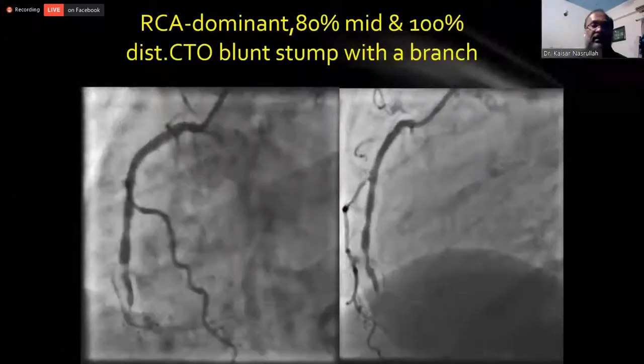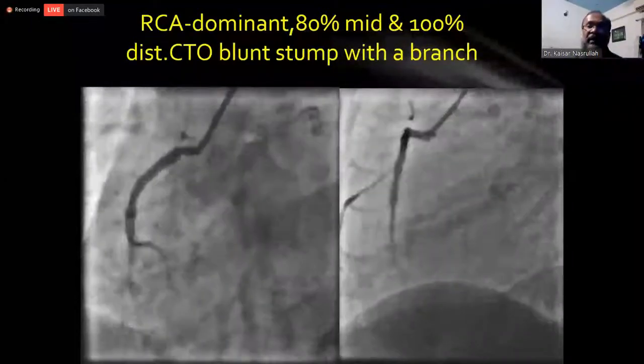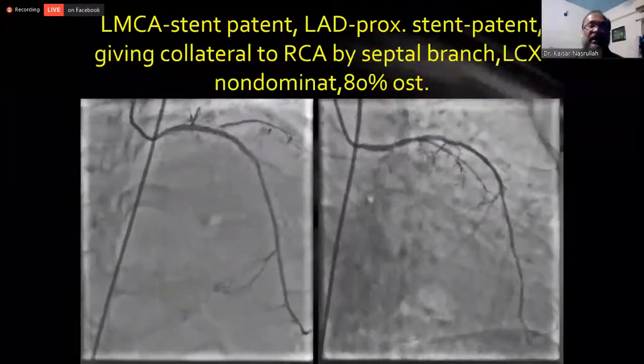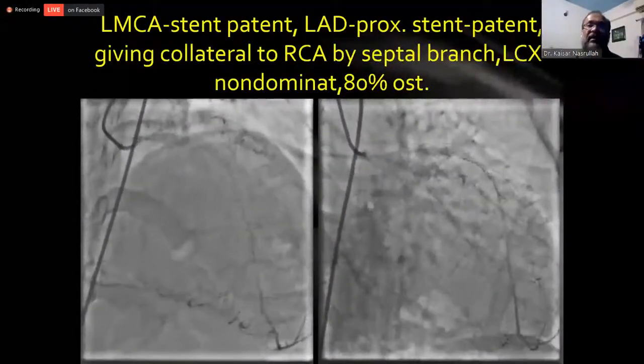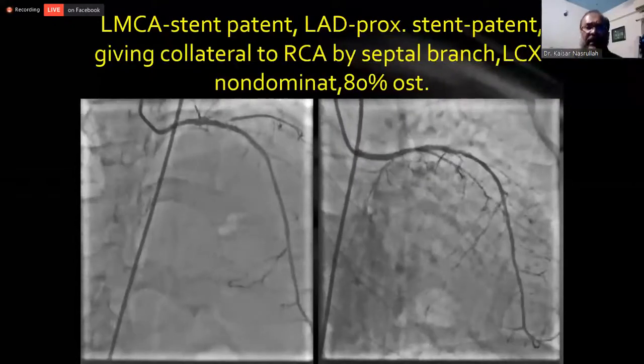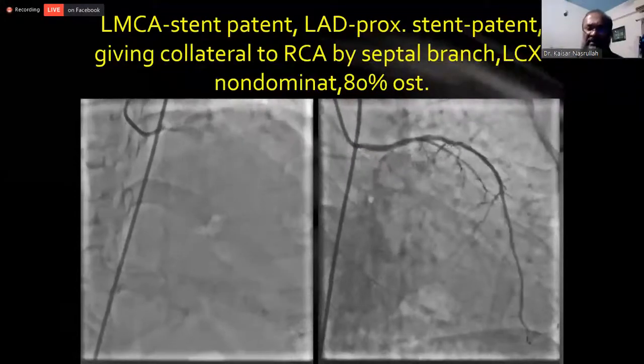So this is an example: RCA dominant, a CTO with a blunt stump with a branch, and the left main coronary stent was patent, and the LAD stent was patent. It is giving collaterals to the RCA by the septal branch. LCX is non-dominant.